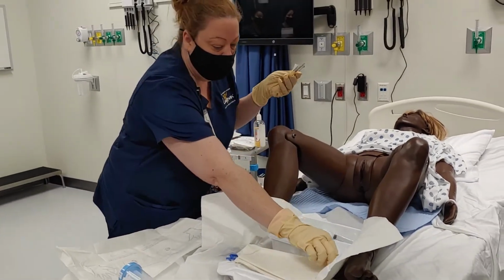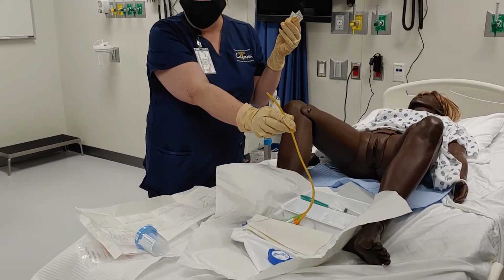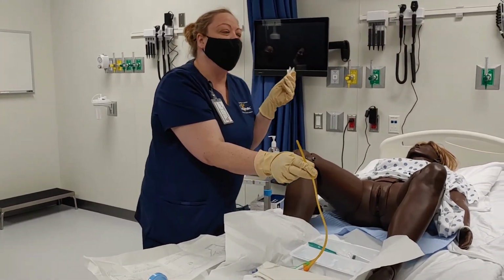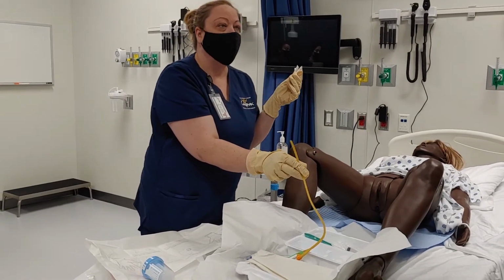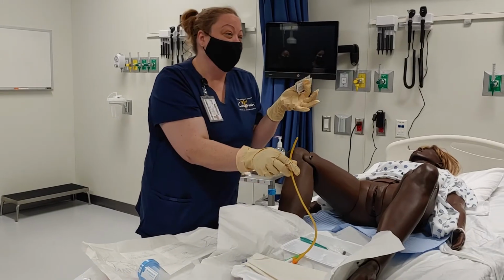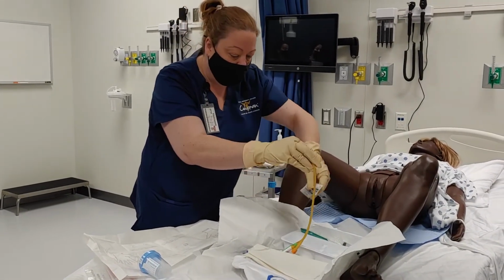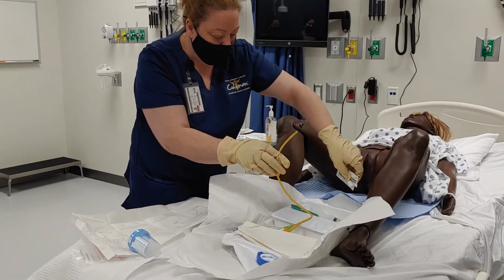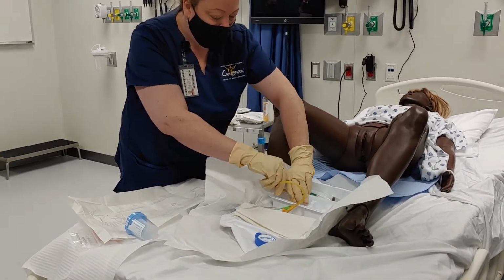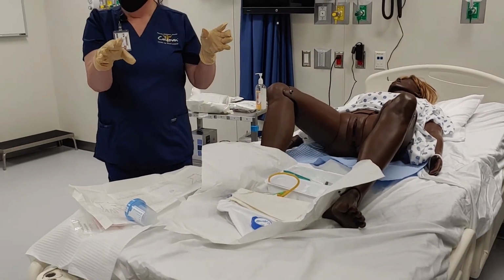Because when we go to put this inside their urethra, if it is not lubricated well, it is not going to go well, all right? Number one, it's going to hurt like the dickens. Number two, you're going to be trying to slide this in something dry and it does not work very well. So we have to lubricate it up. So once I have those squirted in there, I'm going to put those to the side and I'm going to lay this in there so it can just be kind of bathing in the lubricant, all right?